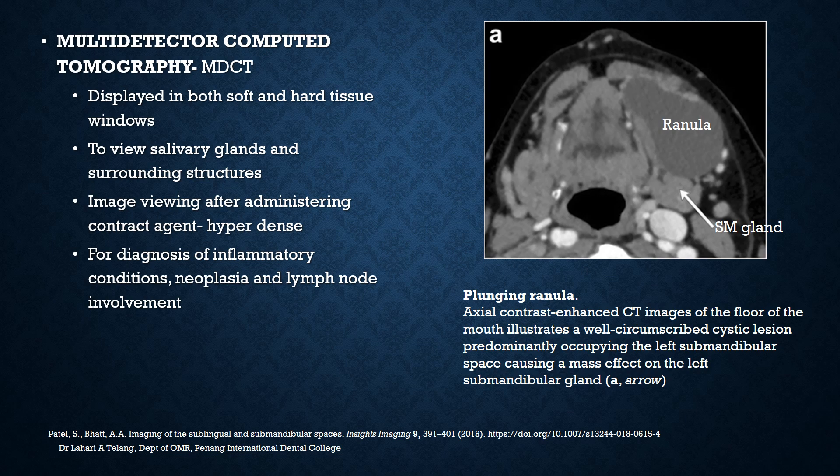This is a case of a plunging ranula, a large space-occupying mass seen on the floor of the mouth. It is a well-circumscribed cystic lesion predominantly occupying the left submandibular space, causing a mass effect on the submandibular gland. You can see that the gland has been pushed to one corner by the large plunging ranula.